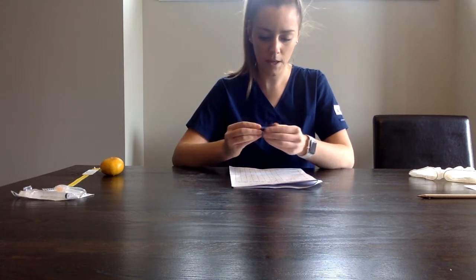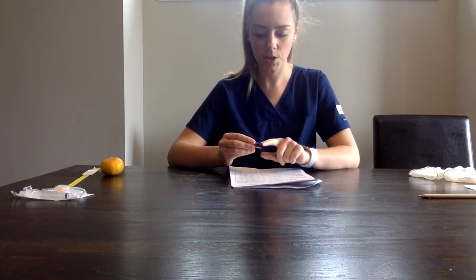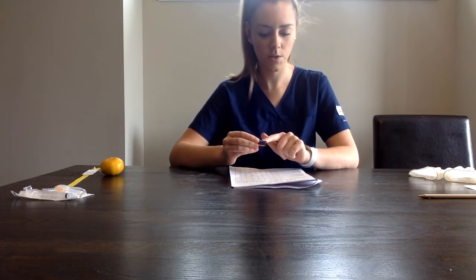We'll begin to select the correct medication and supplies. So we'll do hand hygiene. We'll select the correct med from the narcotic bin. So we have hydromorphone. 2 milligrams is our dose. The concentration is 2 milligrams per ml. So we'll make sure we draw up 1 ml in our needle and syringe.